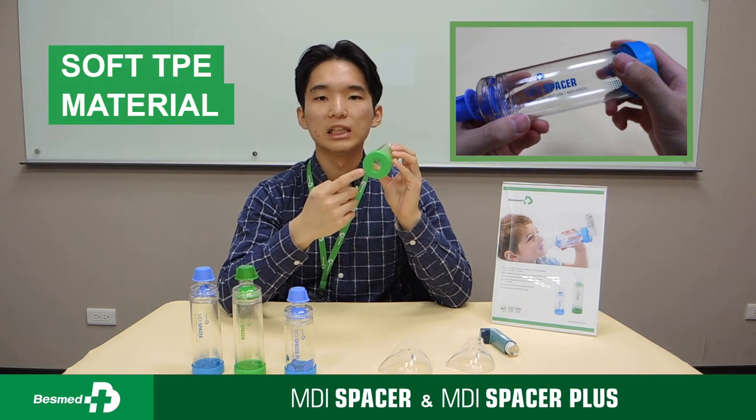Number two: the bottom of the chamber is made of soft TPE material. It is compatible with most common inhalers.